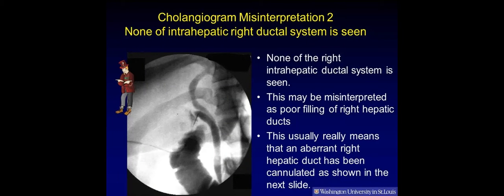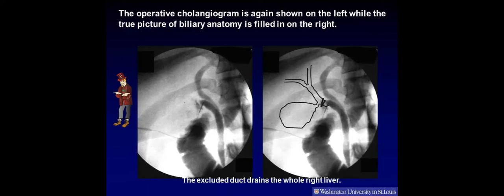Cholangiogram misinterpretation 2: None of the intrahepatic right ductal system is seen. This may be misinterpreted as poor filling of the right hepatic ducts. However, this usually means that an aberrant right hepatic duct has been cannulated. The operative cholangiogram is shown on the left while the true picture of biliary anatomy is filled in on the right. The excluded duct drains the whole right liver.